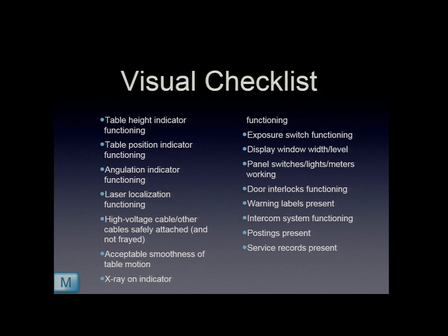The laser localizing functioning. When I hit the light, does it come on? Are they lined up? I go into so many, and I have this side, the laser's here, and this side, the laser's here. And I'm like, wait a minute, this isn't right. And they go, well, this side's right. This one's not. We ignore this. I said, what? And I go, well, as long as they know that, I guess that's okay. But it's really universal through this manufacturer that they focus on one side. And it's usually on. But those are the kind of things you want to look at. Is my laser light working? That kind of thing. Or if I hit it, no light comes on, you want to get it fixed, and so you would document that.